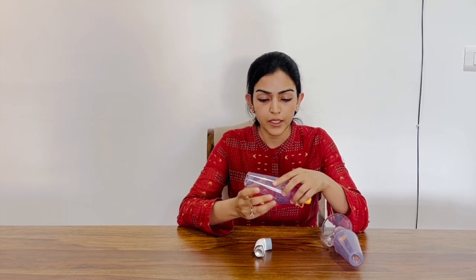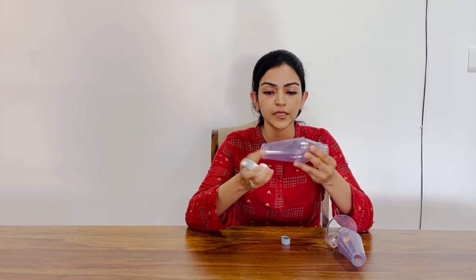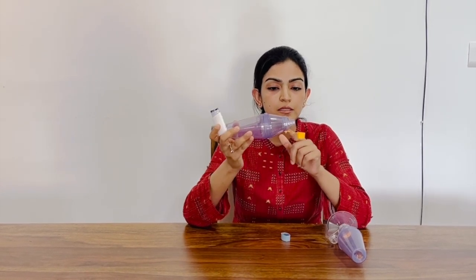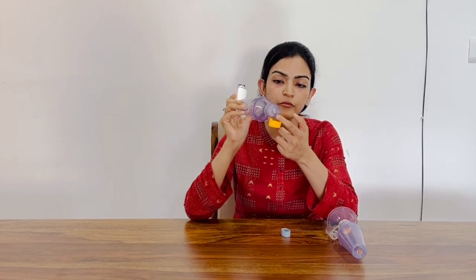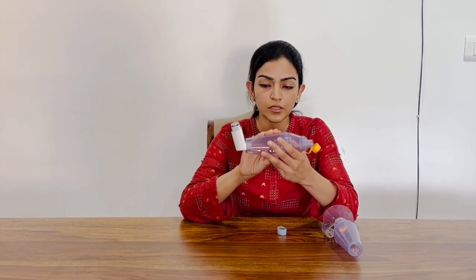The next step is to attach the inhaler to a plastic container called a spacer. Now the spacer basically creates a space between the inhaler and the mouth. So on one end we attach this inhaler and the other end goes into the mouth, and there is a one-way valve near the mouthpiece which allows the medicine to go into the mouth but does not allow it to go backwards. So why do we use a spacer?